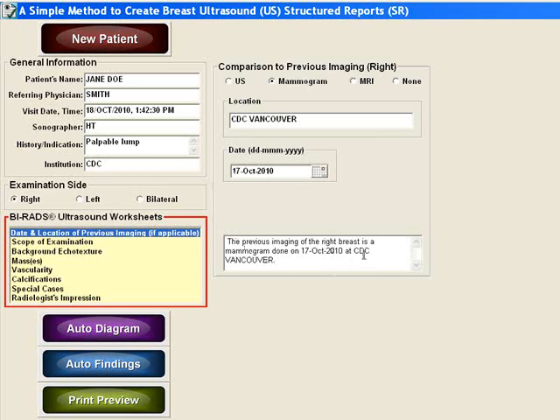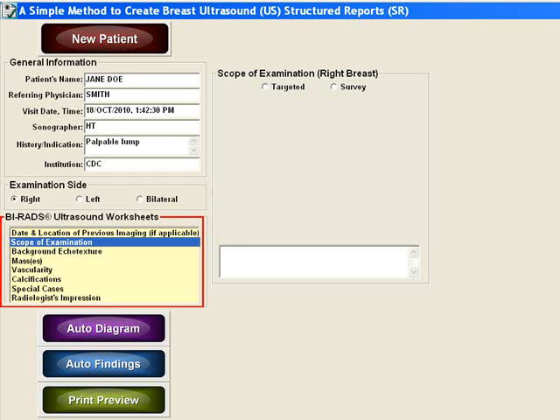The window at the bottom will automatically be populated with a structured report that can be edited. Next you will record the scope of the examination. If it is a general survey of the breast, click on the word survey.